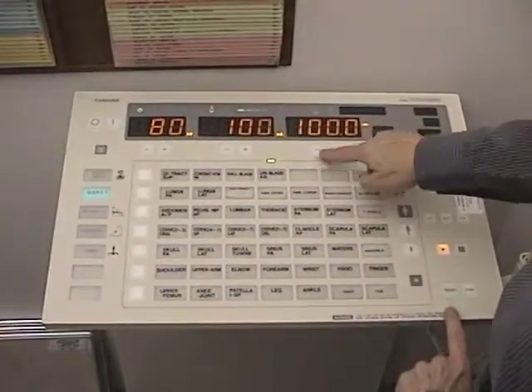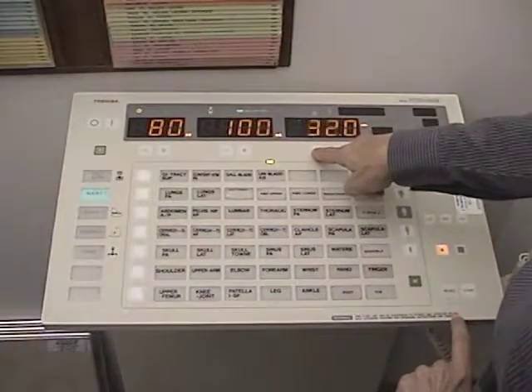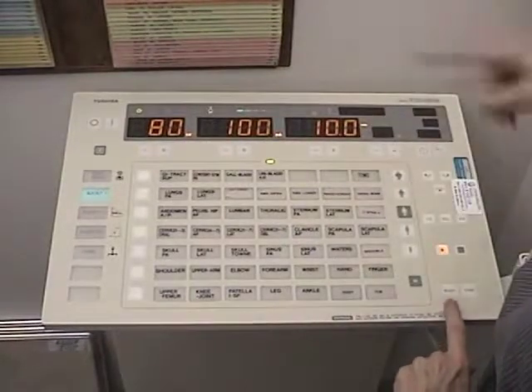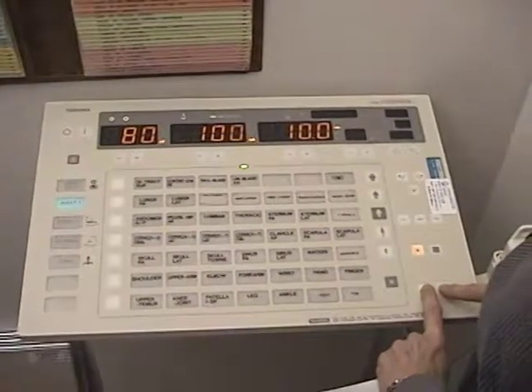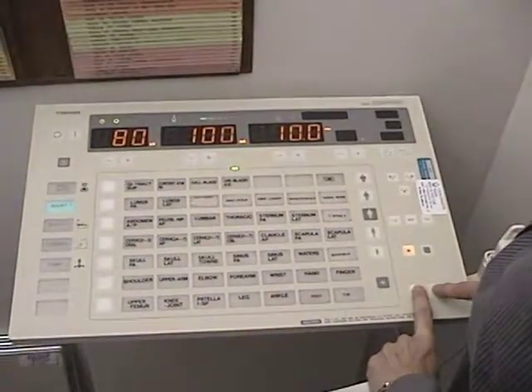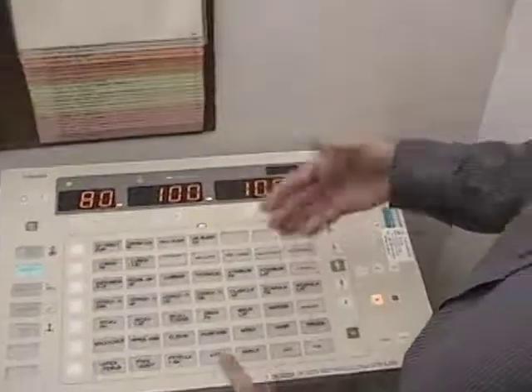One other quick thing. Watch what happens when I actually lower the mAs value to, say, 10, a tenth of the previous one. What you should hear is a much shorter exposure, and you're going to develop an instinct about that as you make your exposures. Now listen for that. How quick that was. And you begin to recognize it as another way of validating that what you just did was good.